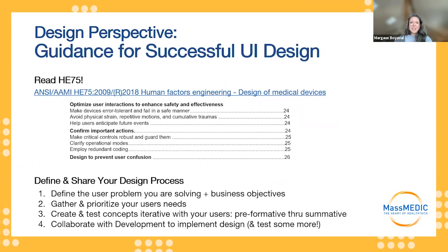Thanks. And then just a couple, if you want to do some reading, I always suggest to read HE 75. It's really a standard for design principles when you're designing medical devices. I pulled a few of the topics that are in HE 75 here.